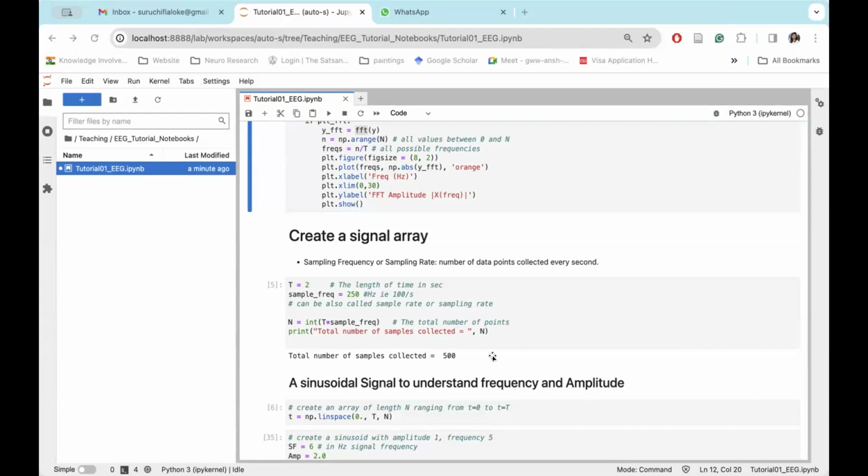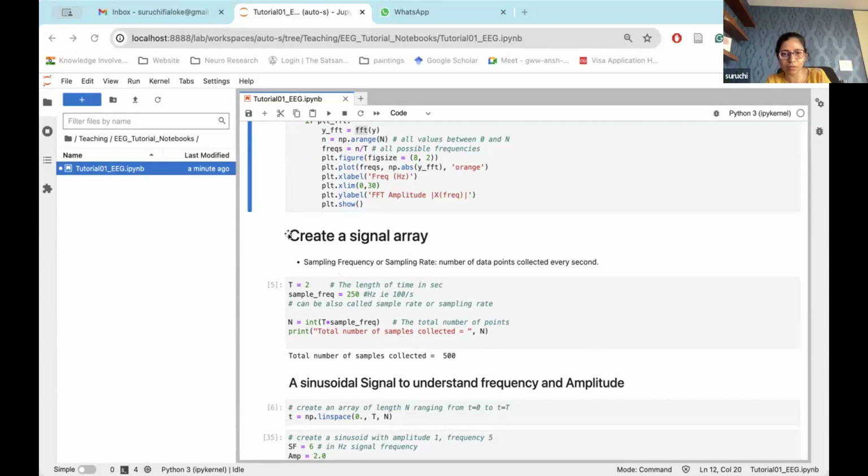So this we've done already. This is the same thing. This is a pure wave. It will give you one peak. If it's a mixture, you can't really tell what is happening here. The Fourier transform will give you the actual frequencies of the prominent waves and also give you the relative amplitudes.